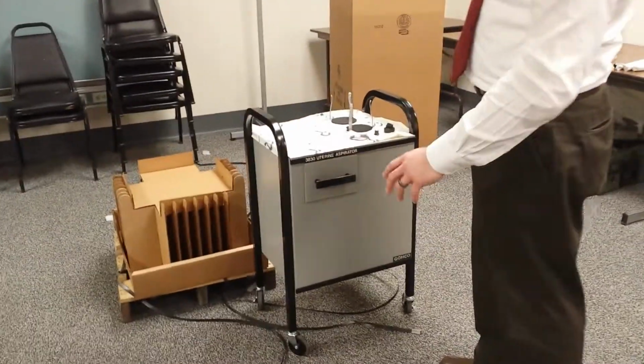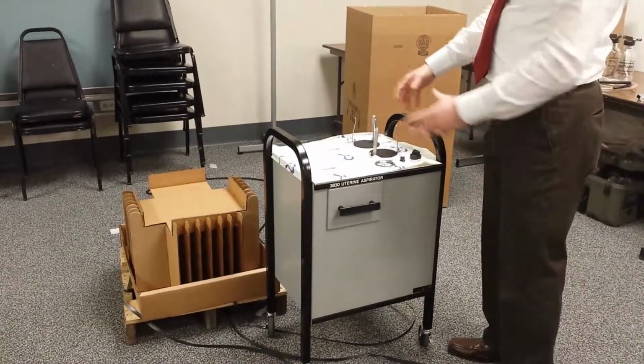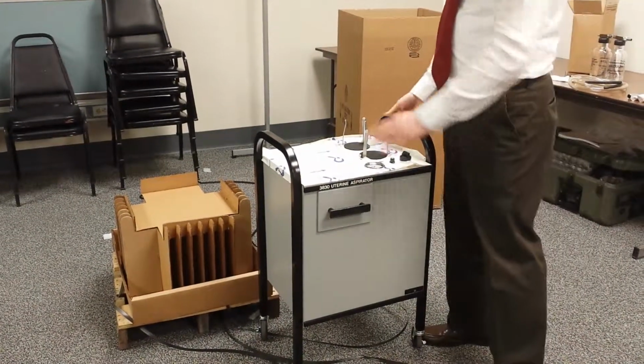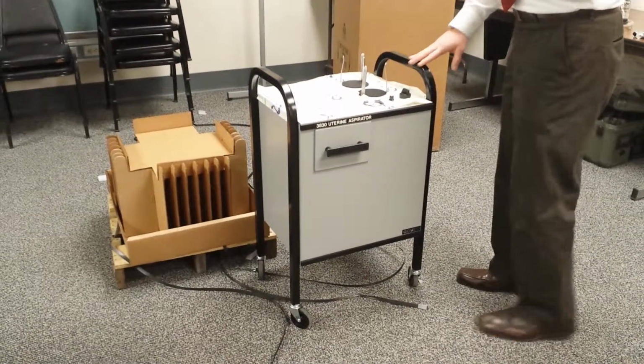Now the Gomco 3830, when it comes shipped from the factory, comes on a wooden pallet inside a box on this crate, and it's covered by a cover box. If you remove the straps, you can slide the cover off the top, set it aside, and then take the aspirator off of the support bracket and set it on the floor.